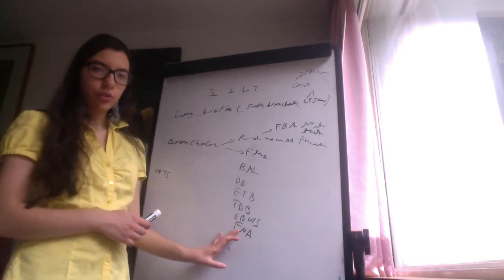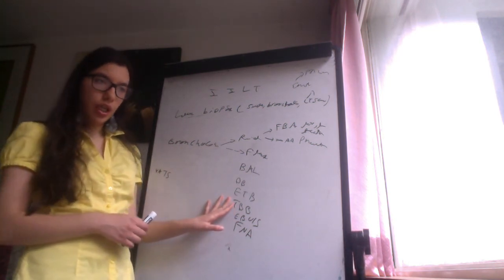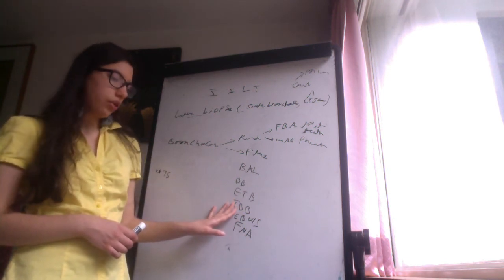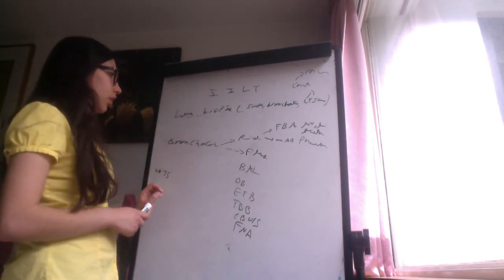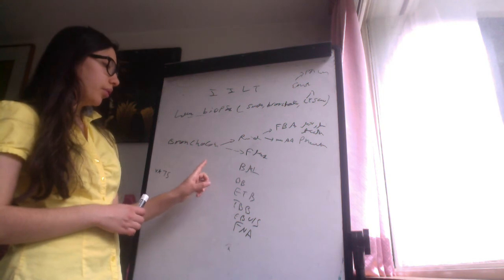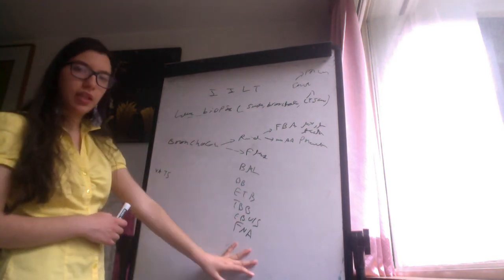Fine needle aspiration is to assess the metastases in mediastinal lymph nodes, and endoscopic bronchial ultrasound is to assess the walls of the airways and surrounding structures. Indications include endobronchial lesions, intrapulmonary nodules, assessing or staging the lung cancer, and mediastinal lymphadenopathy. Now, so we can see that here in bronchoscopy we have some biopsies like transbronchial biopsy, bronchial brushing, endotracheal biopsy, and fine needle aspiration. This is of the mediastinal lymph nodes.